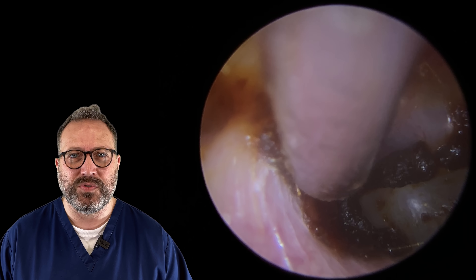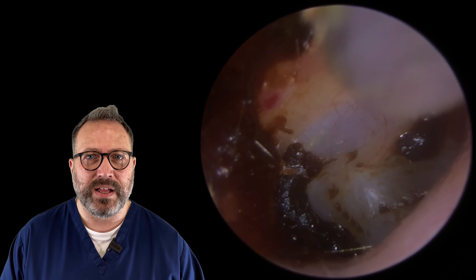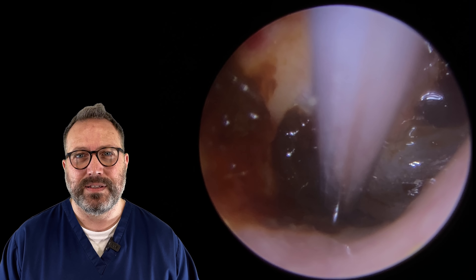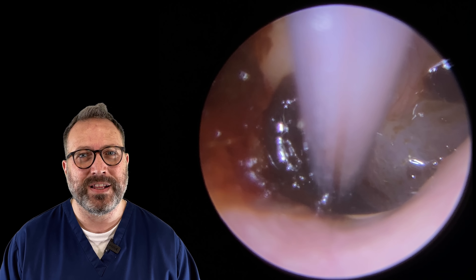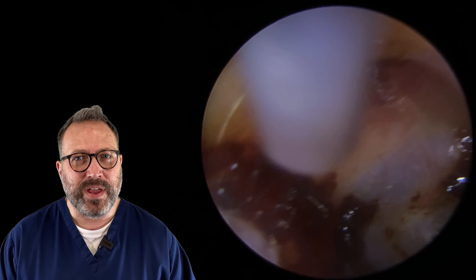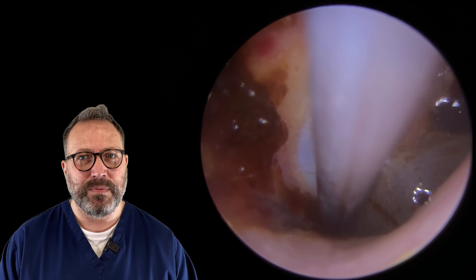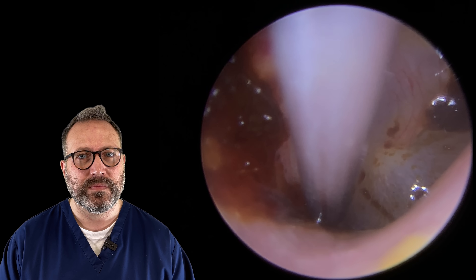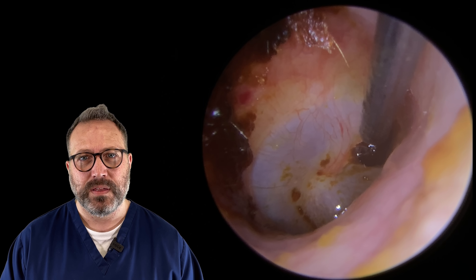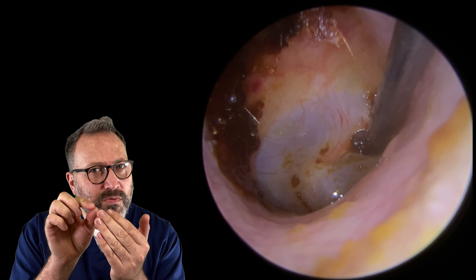Trying to peel this away but it's very, very thin, so let's aim for the central section - let's uncover the eardrum and get this patient hearing better. We've got that central section away now. It's the piece to the top right and the piece to the bottom left remaining. We're going to fine end on here because we're working in a really narrow space, trying to avoid the canal wall and the eardrum. If we aim a little bit higher, aiming for the section at about the nine o'clock mark on the clock face - there, that's gone. Let's take a little bit more from this bottom section. We're aiming now for the piece to the top right corner - very, very slowly - and don't forget the tip of the hammer bone is just behind that piece, so we've just got to be really gentle taking this away. It's come away now.